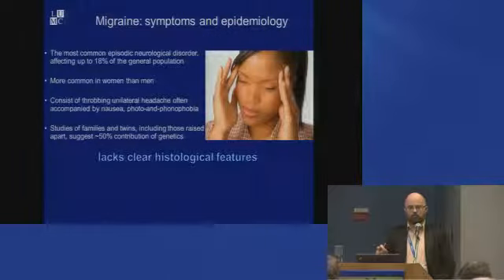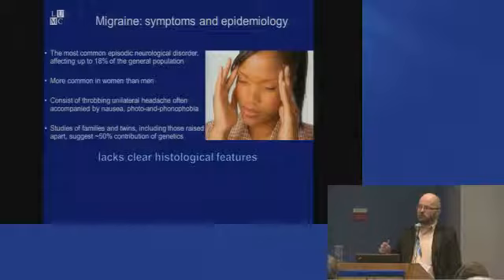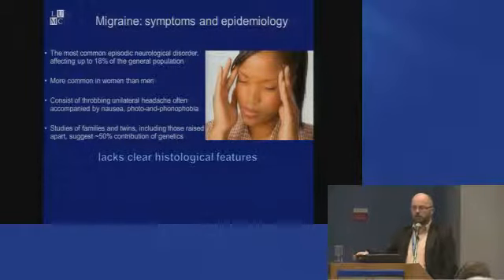One of the crucial parts here is that it lacks clear histopathological features. And so we cannot use a histology-defined sort of virtual microdissection to look for molecular changes, metabolic changes associated with migraine.